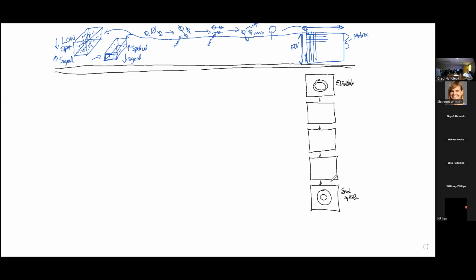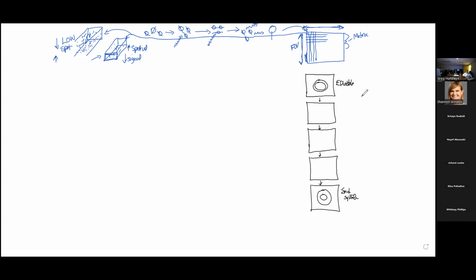So how are we going to do that? Well, what we're going to need to do is coordinate the picture taking with the EKG or some repetitive signal. So let's go to eraser. I'm going to get rid of some of this stuff up here because I need a little more space. Go back to this. Color.